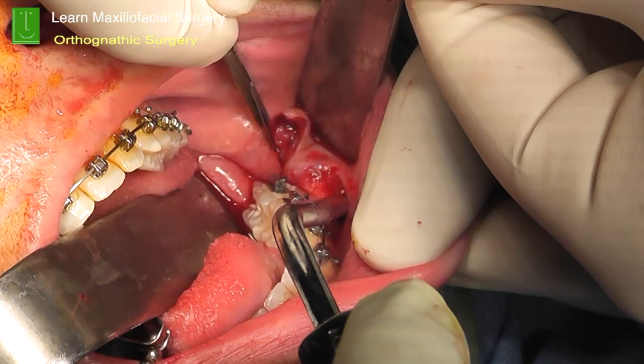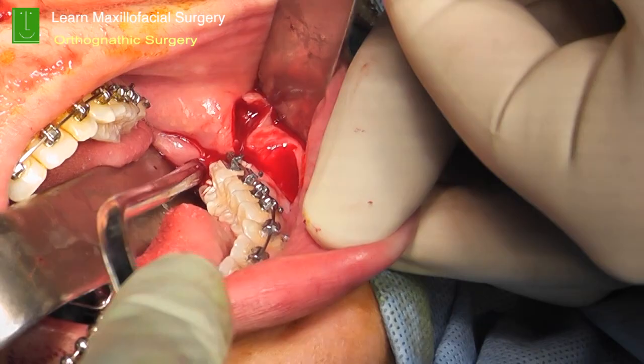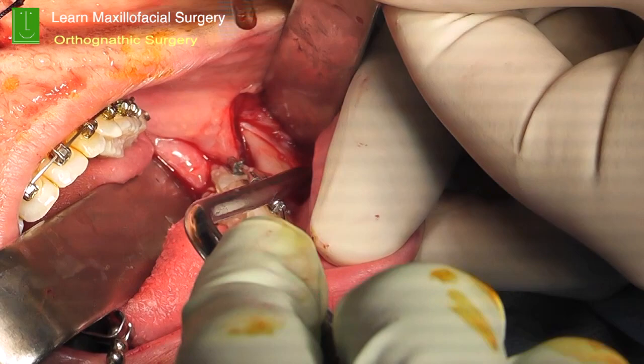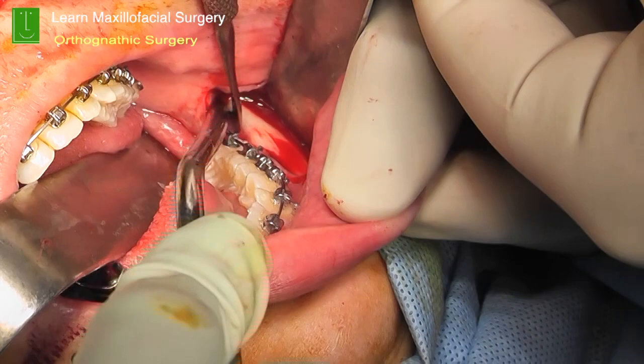If you have some adhesions there, especially if you have taken the wisdom tooth out in the last 6 months, there could be a bit of adhesions, and a combination of sharp knife dissection and then blunt dissection using a periosteal elevator helps. A fine periosteal elevator helps in raising a mucoperiosteal flap, and that's what you're seeing with the Austin retractor. You can see the way in which the buccal flap is completely stripped from the retromolar area. That's the subperiosteal plane which you need to go in. And once you're in that plane, there is really very minimal bleeding, and that's one nice thing.